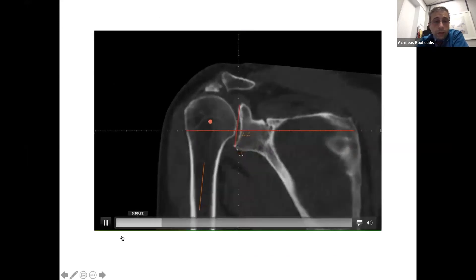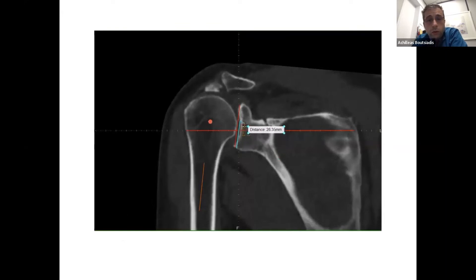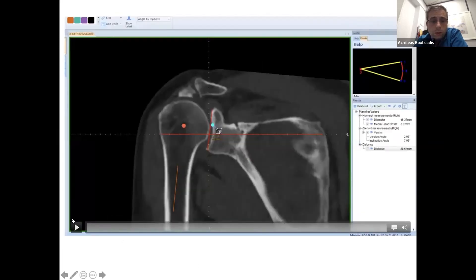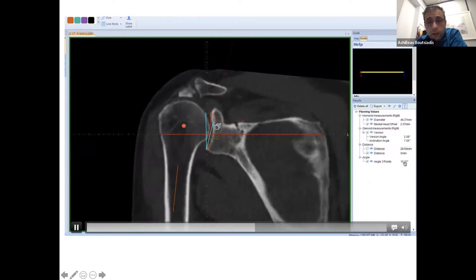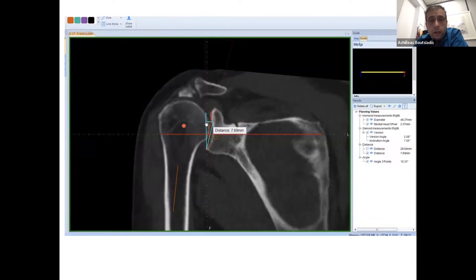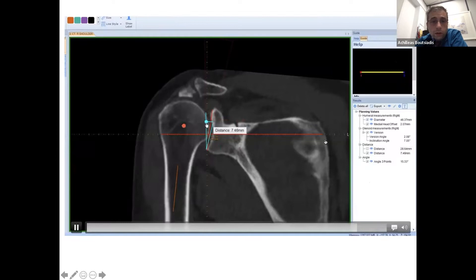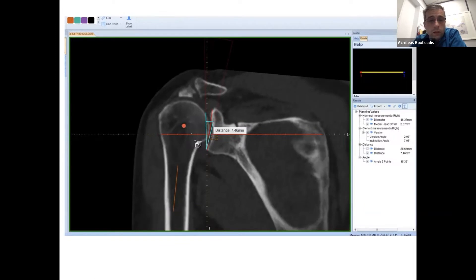Using the MediCAD software, we can measure the millimeters — going to 26 or 27 millimeters — and at this level measure the RSA angle, which is the inclination of the inferior part. In this example, it was 7 degrees but is now 15 degrees, so we need to correct it. We measure the distance from the glenoid to the ankle: about seven millimeters — which is the offset of the bio-RSA or the metal augment posteriorly that we need to choose. So, either a 7mm bio-RSA or 7mm metal augment posteriorly to the base plate.